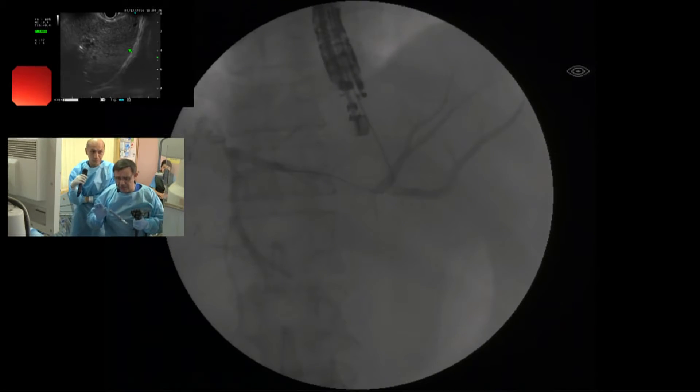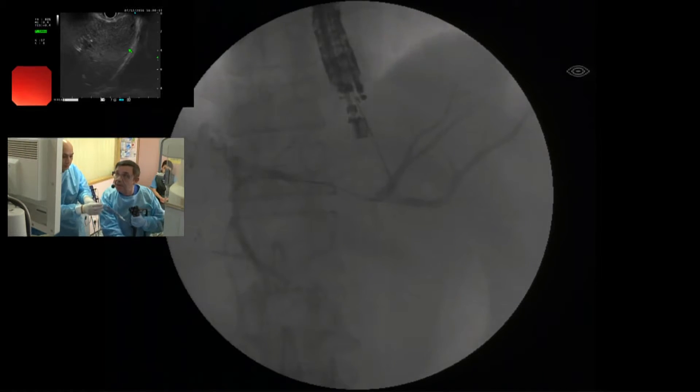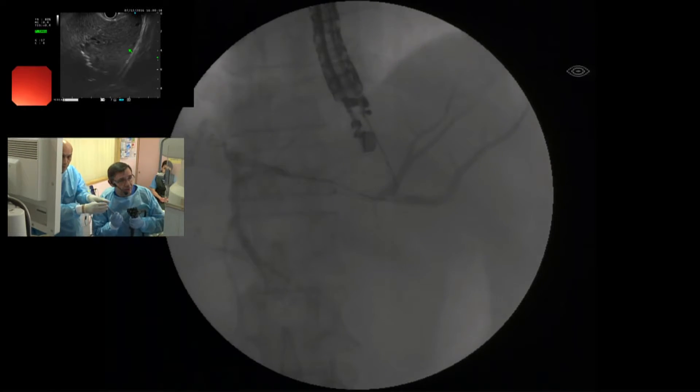Very good. Now I will do the exchange and I will use the cystotome. We do the exchange. If you can maintain the scope like this, please — this is very important.